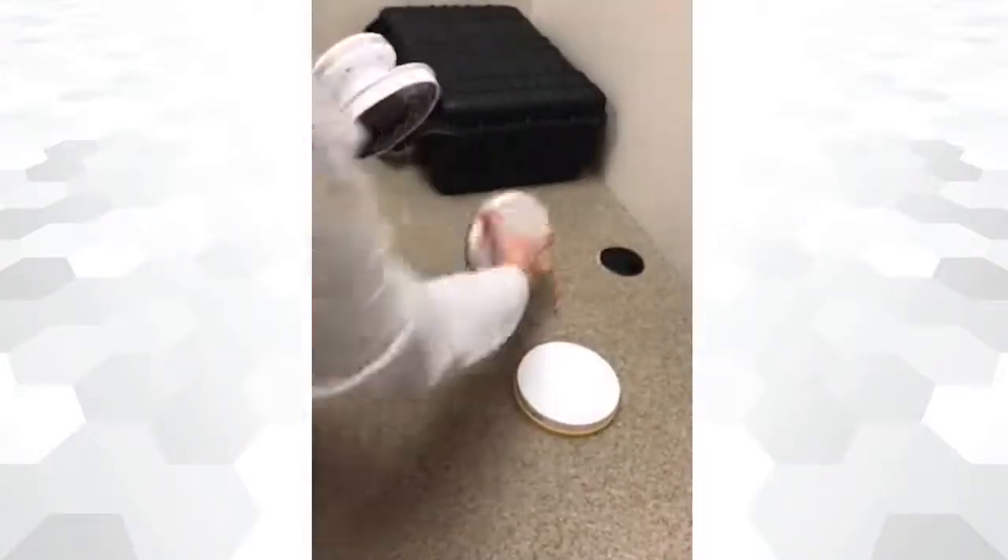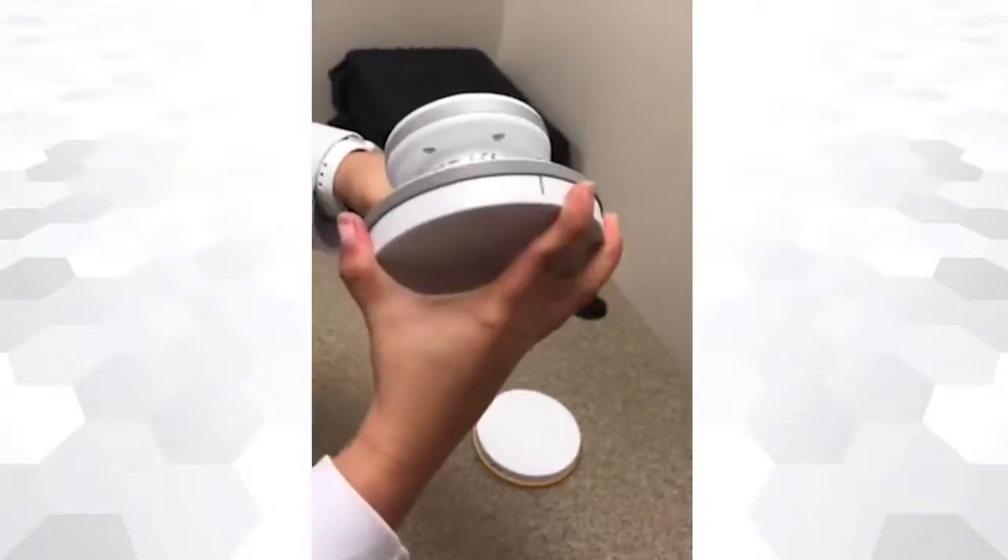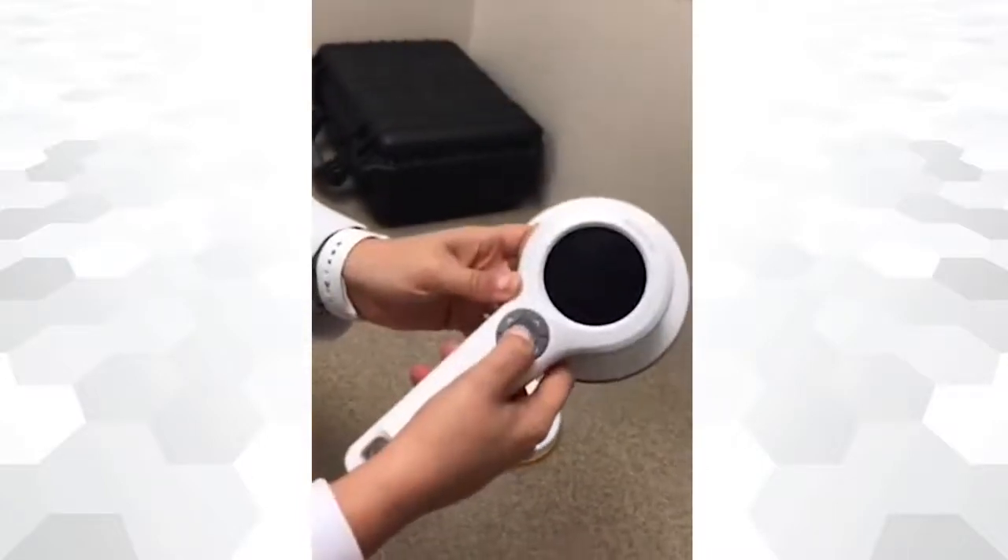To place a lid, simply align the black line from the lid with the black line in the detector and twist to lock properly. The device is now ready to use.